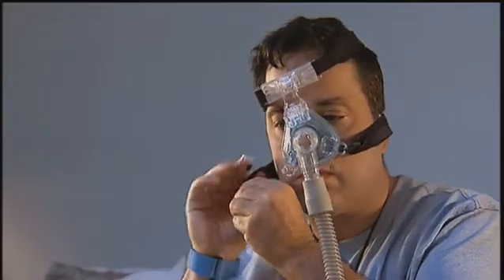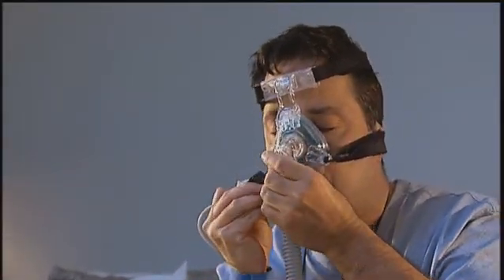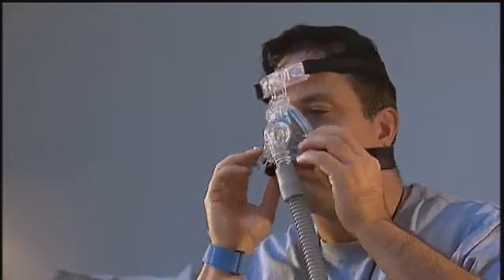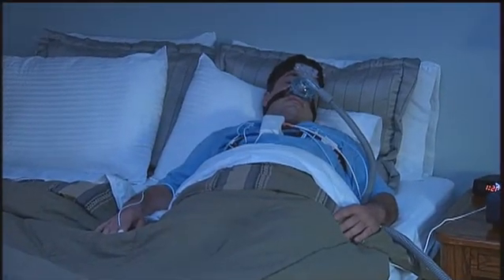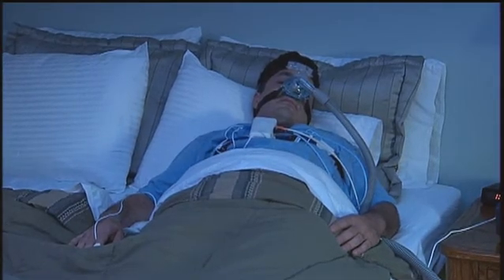Once the Alice PDX is connected to the therapy device, position the mask on your face according to your provider's instructions. Have the mask rest comfortably and securely. Once your mask is in place, turn on the device so air is flowing into the mask. You now can go to sleep.